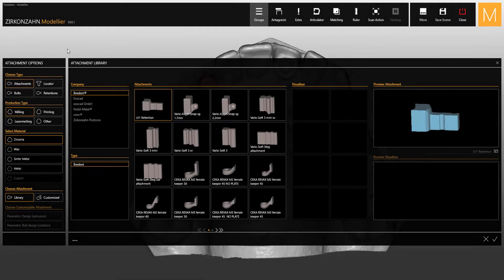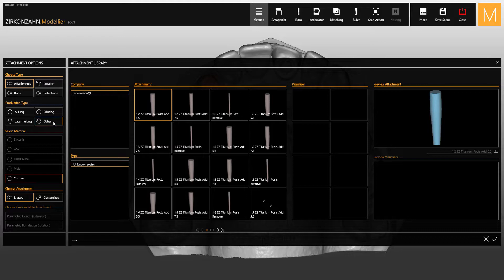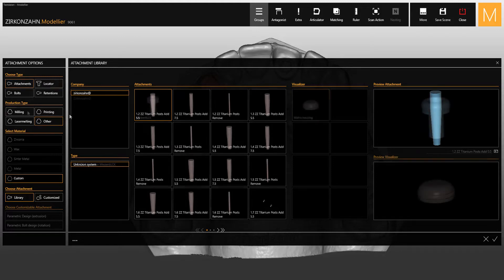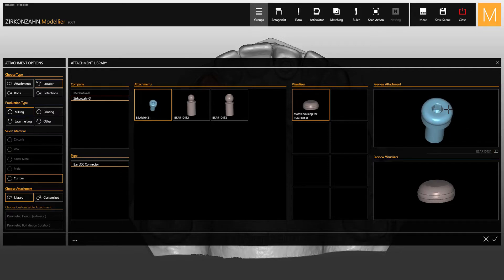There are four different kinds of objects in the library: attachments, locators, bolts, and retentions. Once you have chosen the object, select the production type in order to find different libraries. Among the new features, you can now use a preview window for the 3D visualization and find a screenshot function which allows you to create your own pictures for the attachments.